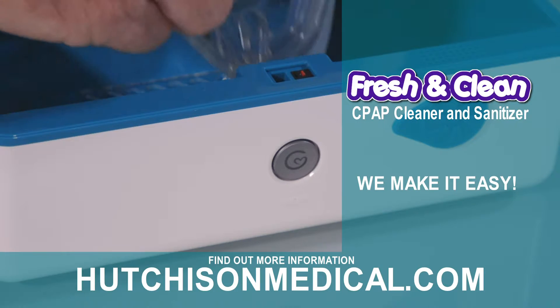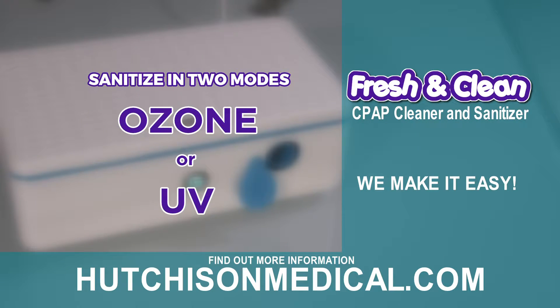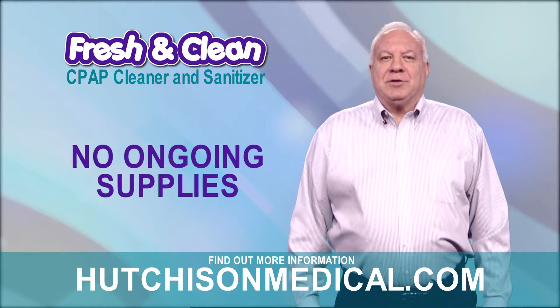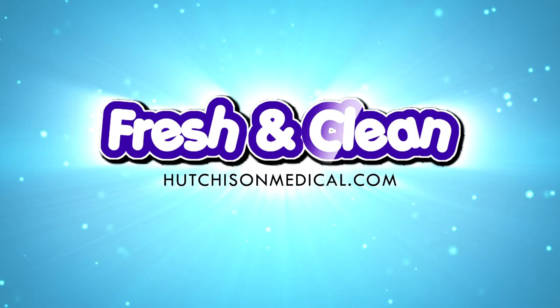The Fresh and Clean makes it easy, and you can sanitize in two modes, ozone or UV. Best of all, it's half the cost of other machines, and you don't need ongoing supplies. Learn more at HutchisonMedical.com, based right here in the heartland.